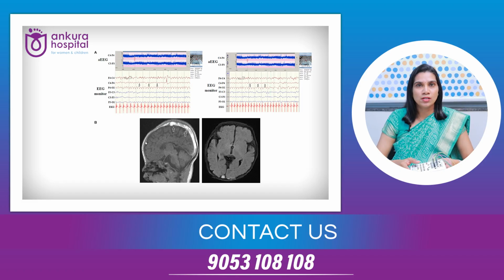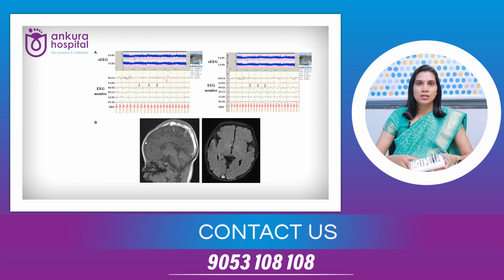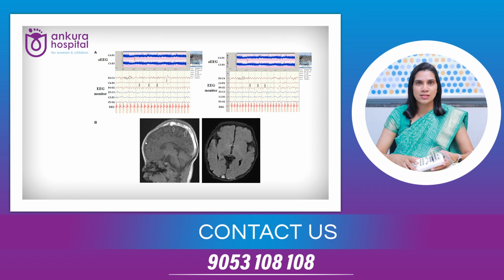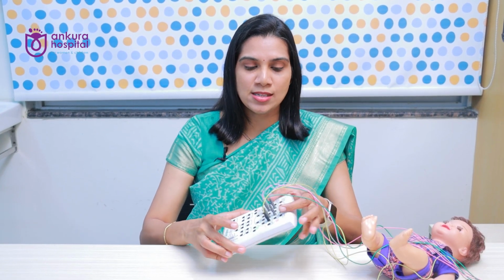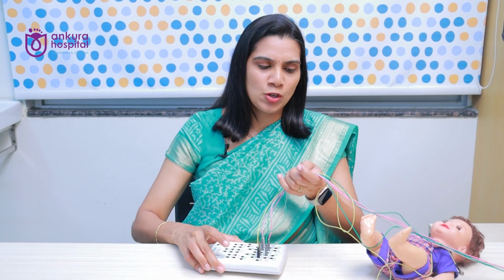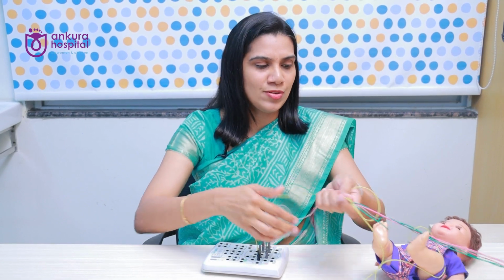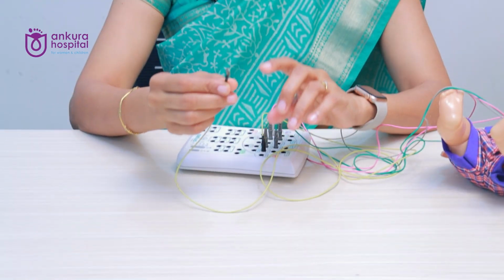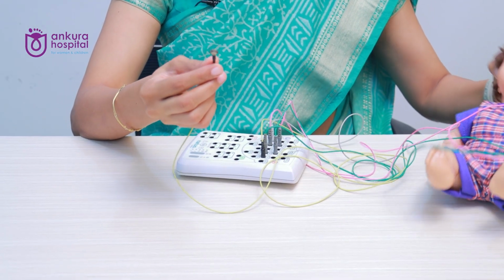These days we are recording digital EEGs only. Digital EEG is nothing but the signal from the amplifier getting converted into digital waveforms and displayed on the computer screen. So this is how the amplifier looks, and these are called the leads. Depending on the requirement, the number of leads will vary, depending on the age also. This is called the electrode, as you can see. The electrode has a cup, and this will record the signal.